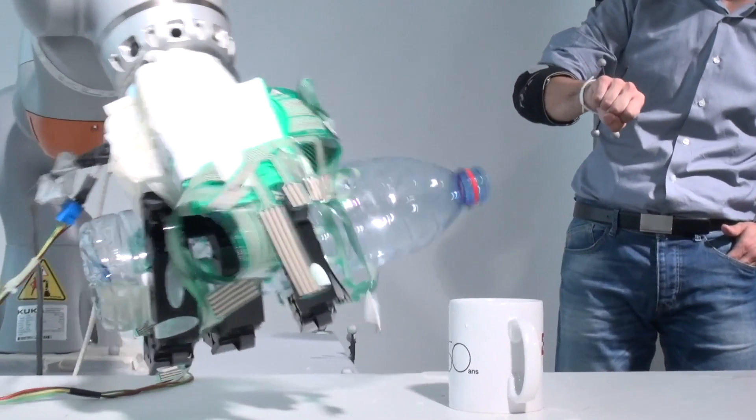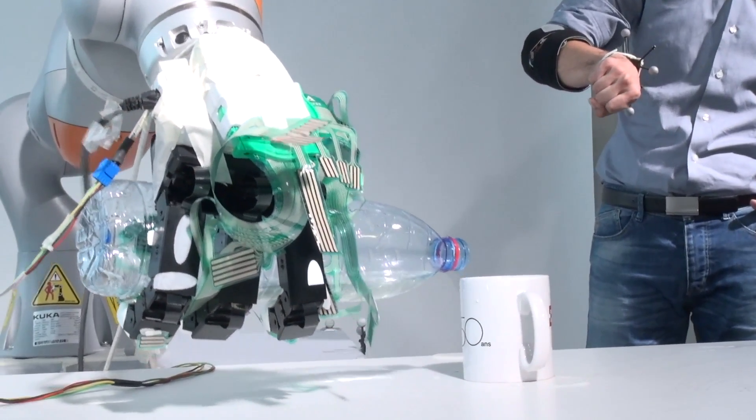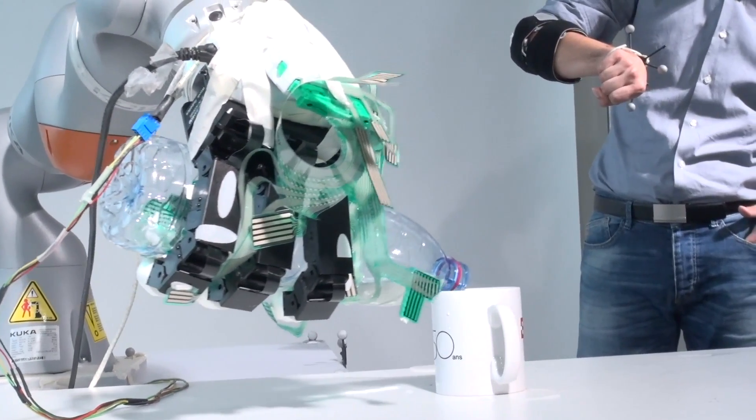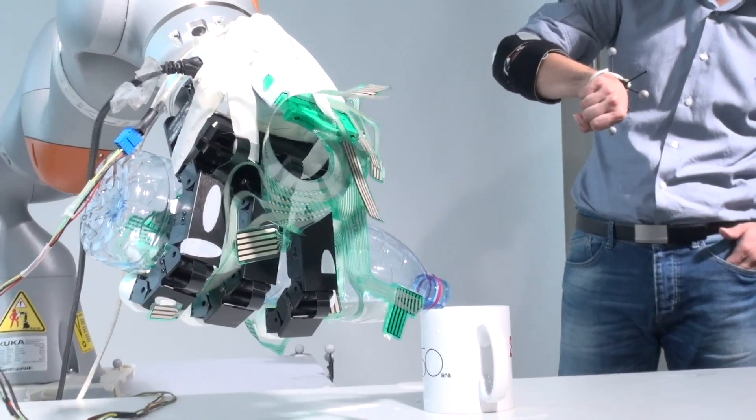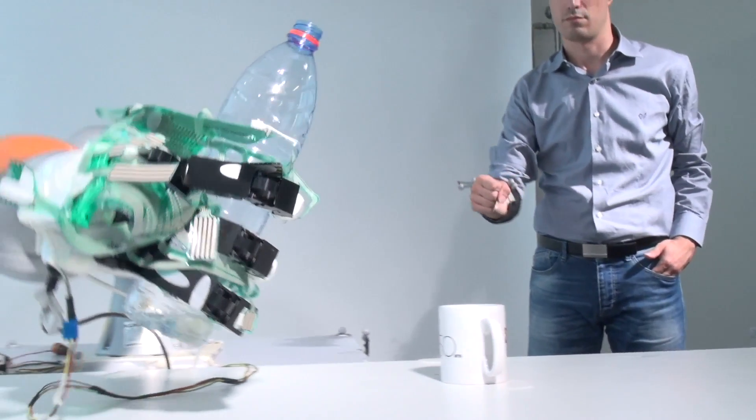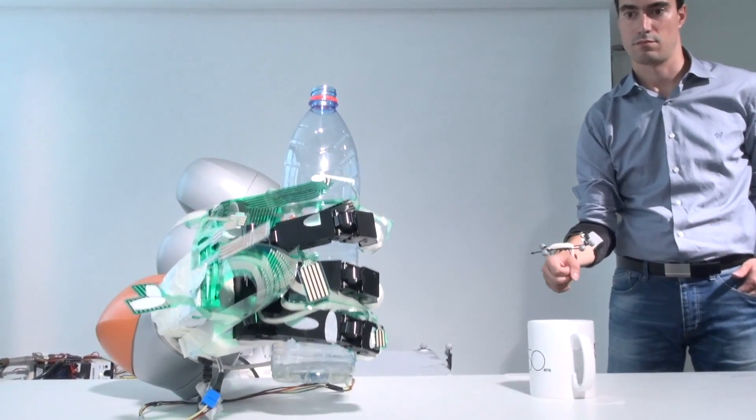What we're doing is we're developing a very smart prosthetic hand that allows an amputee to control each finger individually and also benefit from the aid of robotic assistance to grasp easier.